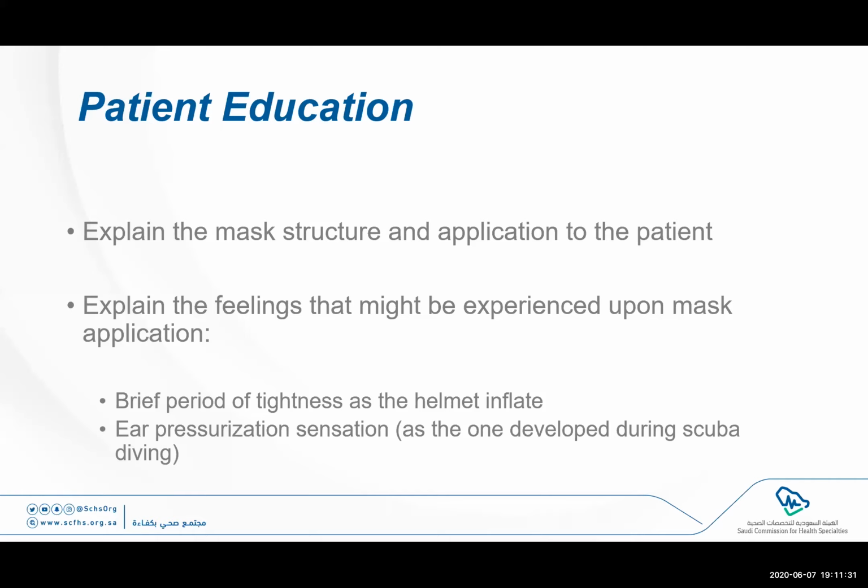Also, the patient needs to be aware of the sensations and the feeling that might be experienced upon the mask application. As the mask is being applied and as it's getting inflated, the patient might get some sort of tightness sensation until the flow starts and the helmet inflates. Also, an ear pressurization sensation, because we are submitting the entire head to positive airway ventilation. So the patient might develop a sensation similar to what happens during takeoff or landing in airplanes or during scuba diving, and they should be aware of it.